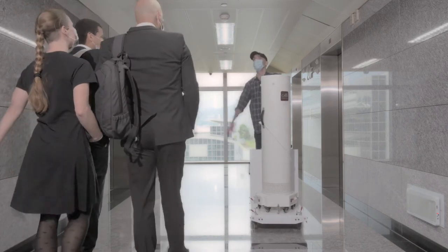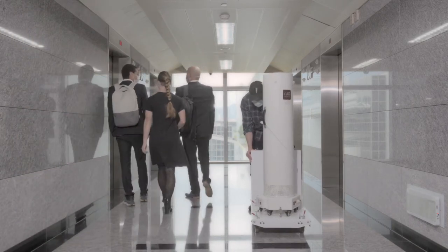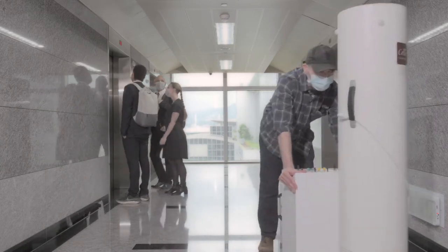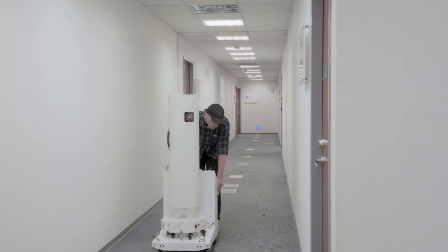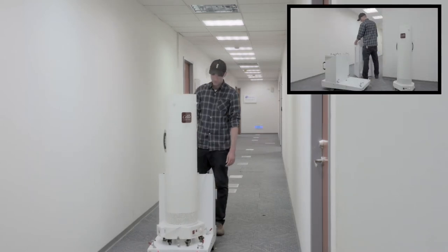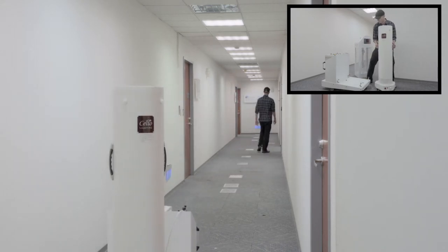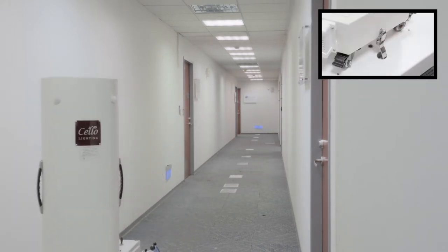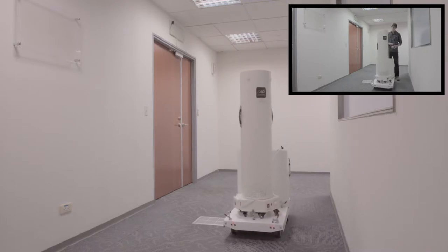Cello Omni can be integrated with the Cello UVC Robot to deep clean air and spaces without any labor. The Cello UVC Robot is a universal robotic platform which can be integrated with different Cello disinfection carts.